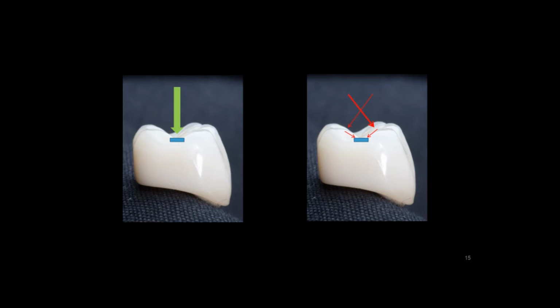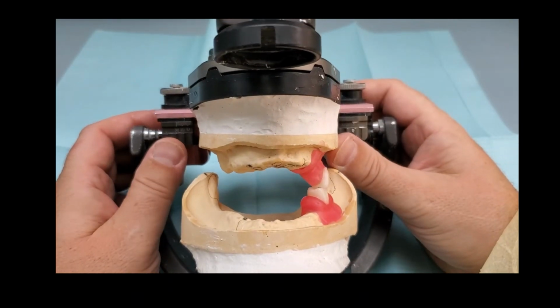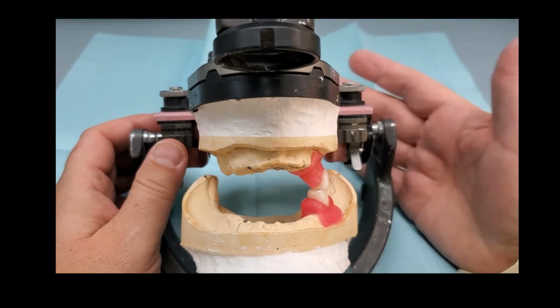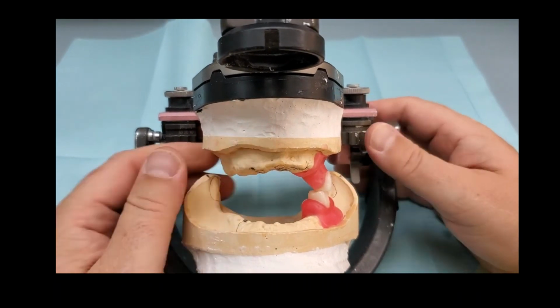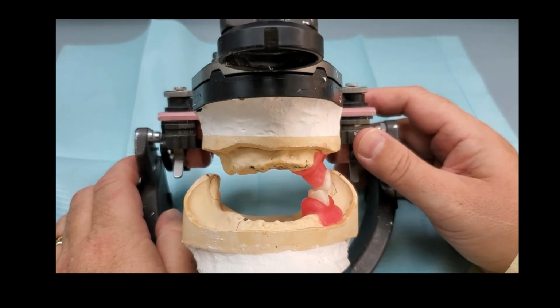It has to be mortar and pestle. You have to have that little helicopter pad to land in, and you don't want the hit and slide. So this is what it looks like on an articulator. We move the articulator like this. This is our standard motion that we were taught. You take it and you do working and balancing contacts. So this is me doing standard working and balancing contacts, okay? And this is how we would typically move an articulator.